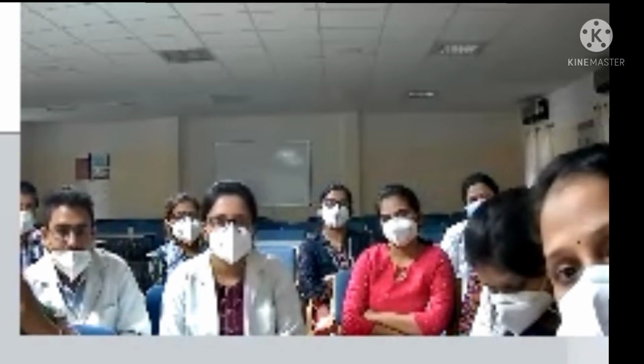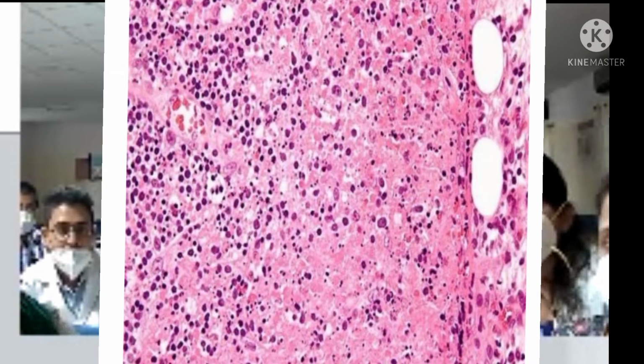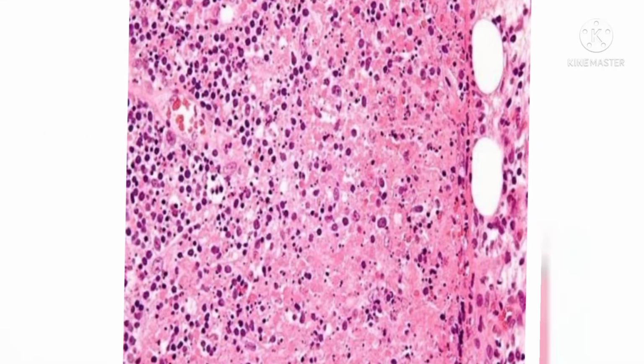So we'll go to the next slide. Can you explain what is going on in this lymph node? There's necrosis with karyorrhectic debris, no? Inflammation without neutrophils, suggestive of Kikuchi's disease. So necrotizing lymphadenitis. You're saying necrosis in the lymph node. You describe the necrosis as necrosis with karyorrhectic debris. Then what else is important? There are no neutrophils present in the inflammation. What else?